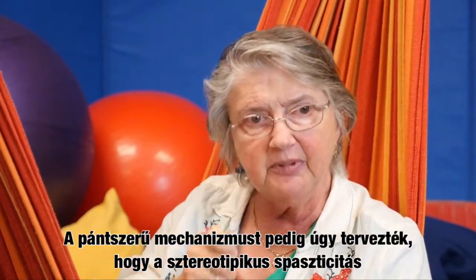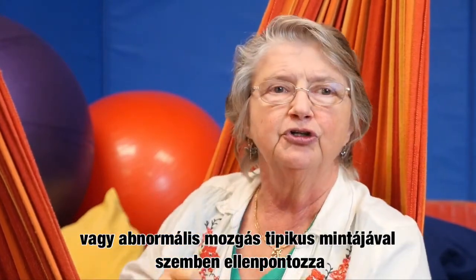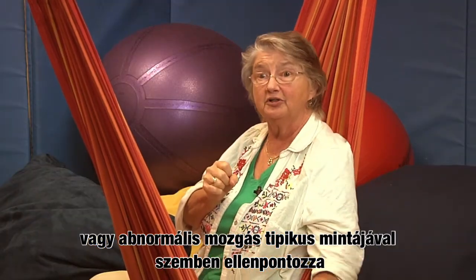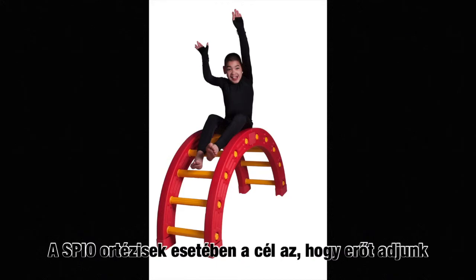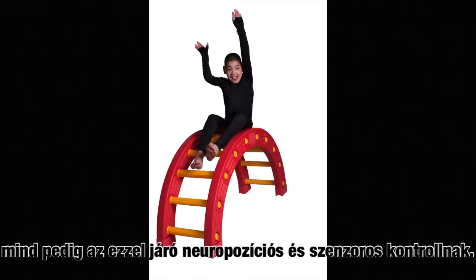And then the strapping mechanism is designed as a counter pull to the typical pattern of stereotypical spasticity or abnormal motion that is seen with that child. With Spio orthosis, the objective is to give power to both the biomechanical alignment and stability and to the neuropostural and sensory control that it provides as well.